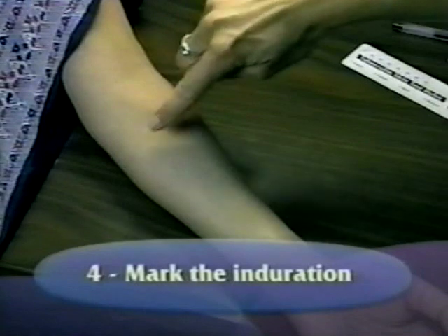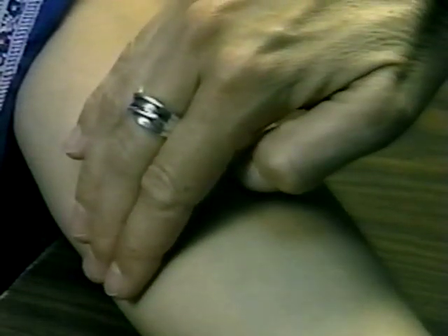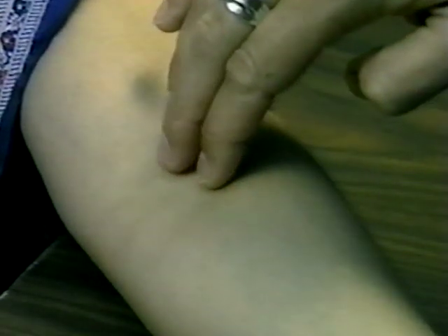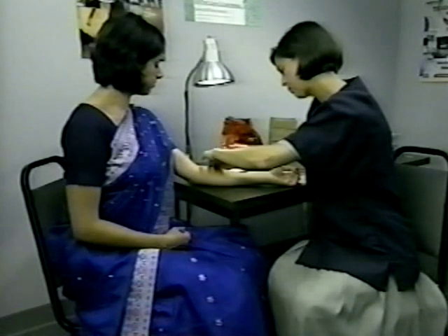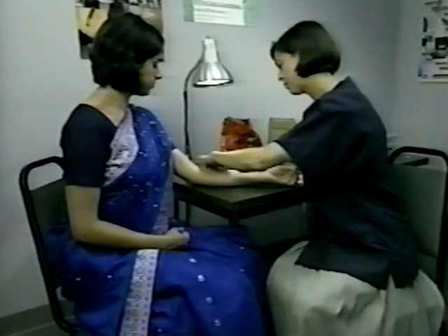The diameter of the induration is measured across the forearm from the thumb side to the little finger side, or vice versa. To mark the edges, hold your palm over the injection site with your fingertips at the outer edge of the forearm. Without lifting, move the fingertips toward the induration. Rest one fingertip firmly against the induration margin before marking. Mark lightly with a fine dot at the widest edge, using the fingertip as a guide. Repeat from the other side and place the second mark. Palpate again to double-check that the induration was marked correctly.